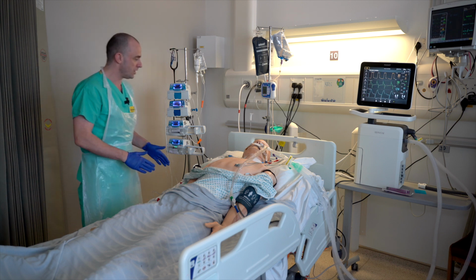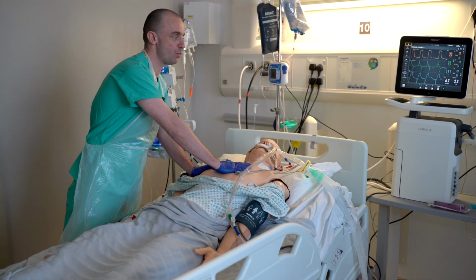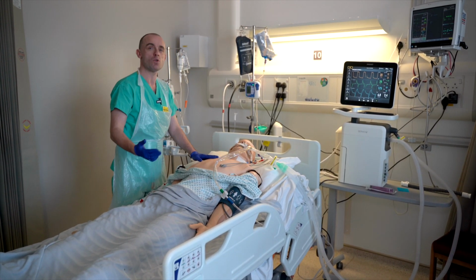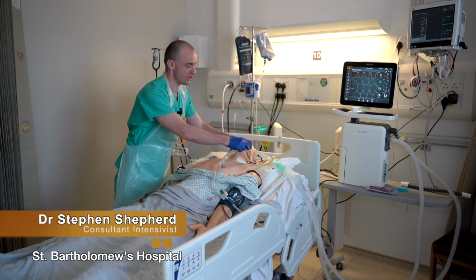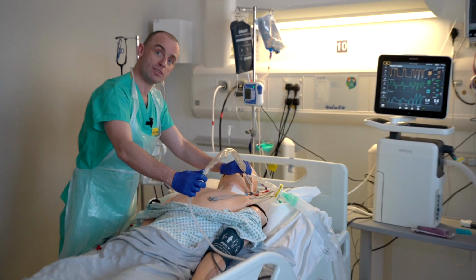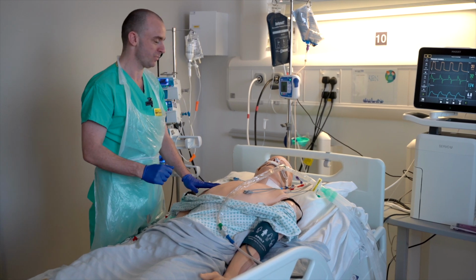I'm going to have a look, and I'm going to have a feel, and I'm going to feel for chest expansion. I'm also going to be able to, with that, feel for secretions. Patients who have purulent secretions, you can feel those and you can feel rattling. And again, here we have an inline suction. It's really important with the coronavirus patients that we avoid inadvertent disconnection. So using this suction catheter, we're able to pass it into the trachea and suction secretions by pressing this and pulling. You can have a look at them, see if they are green or unpleasant, which might suggest infection, or if they're frothy and white, which you might find in pulmonary edema.